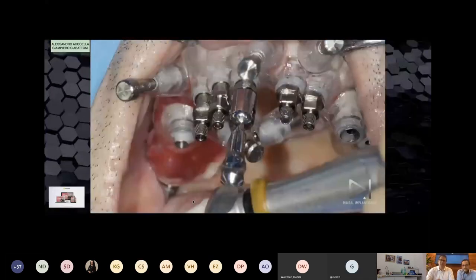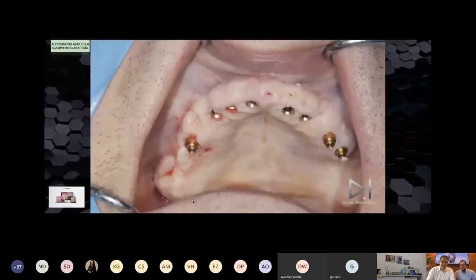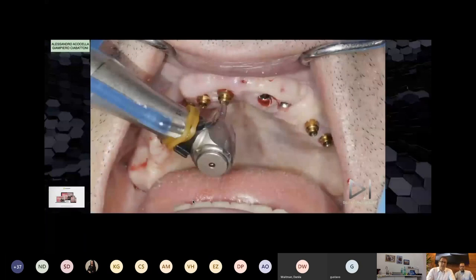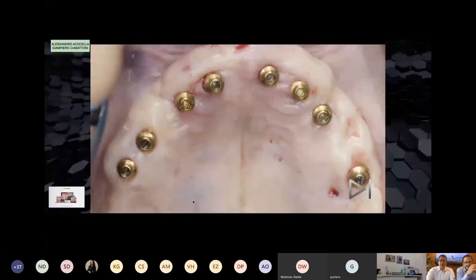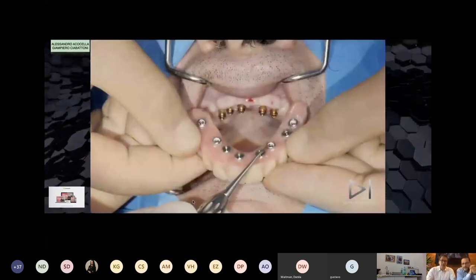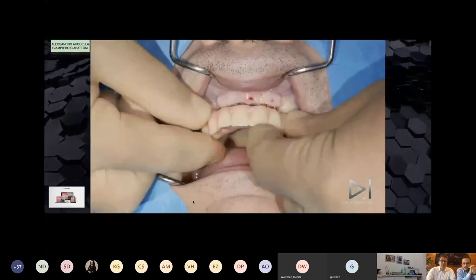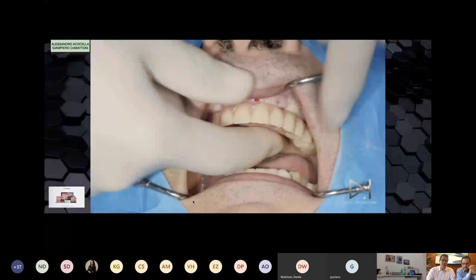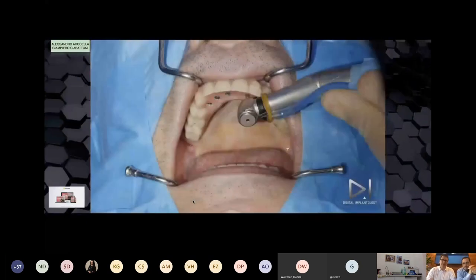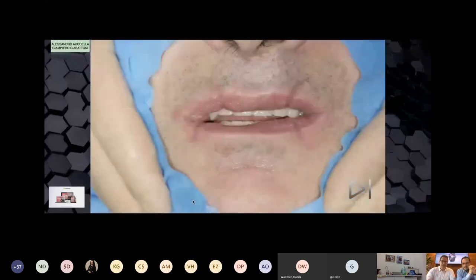After the final adjustment of the position, we can remove the abutment without tension, and now we are ready to insert the Alpha Lock abutment selected before in our virtual model. In this situation, after the surgery, we can immediately, like an overdenture, have the fixation without screw. The prosthesis remains in position, and now I can screw my prosthesis and check the closure because everything was already made before the surgery.